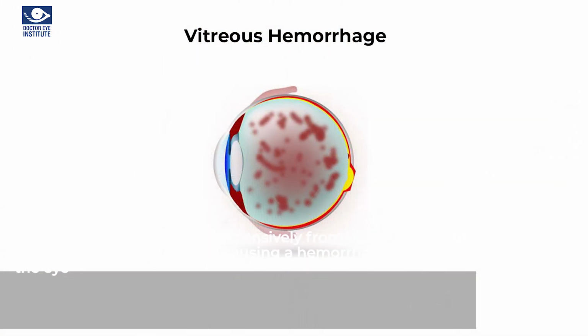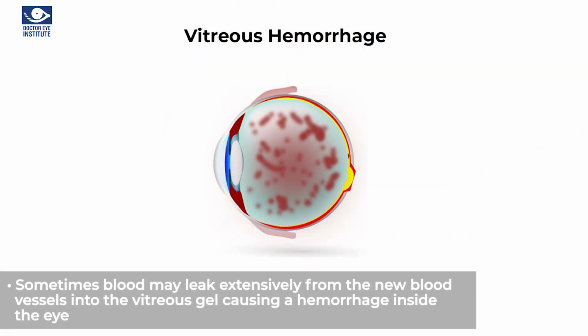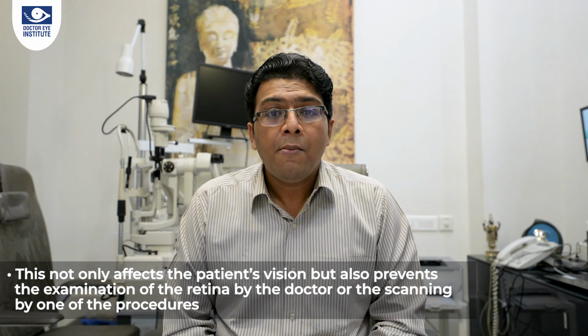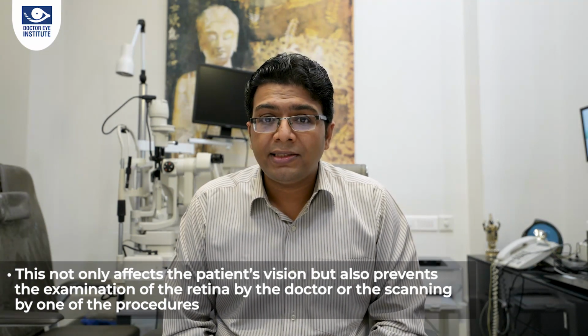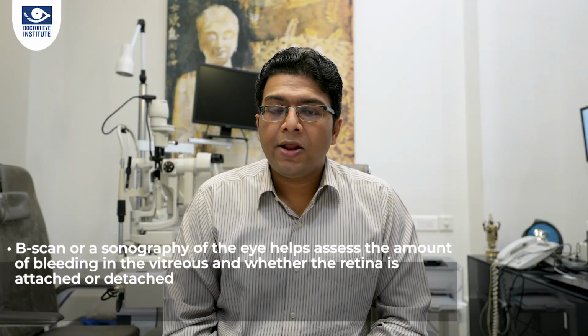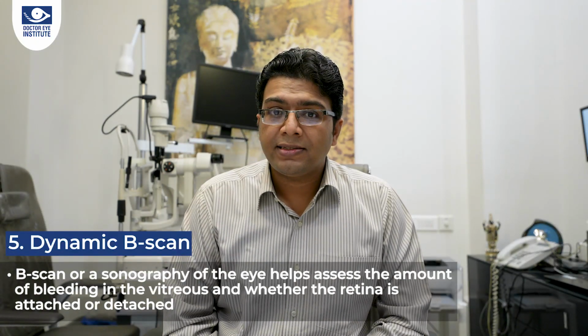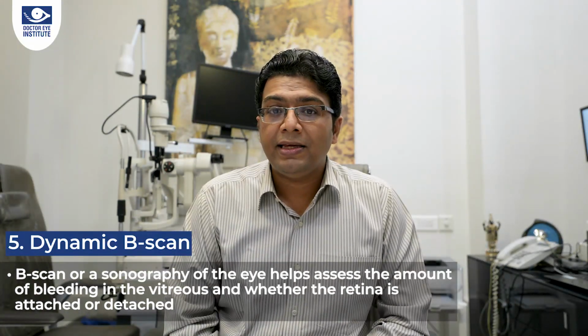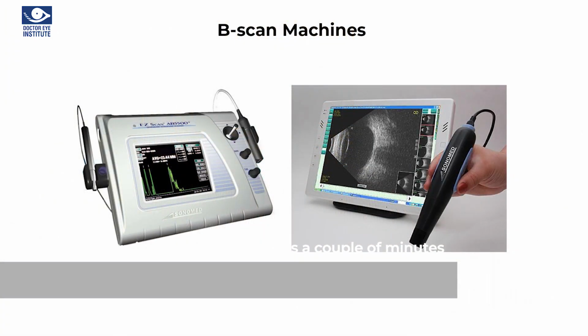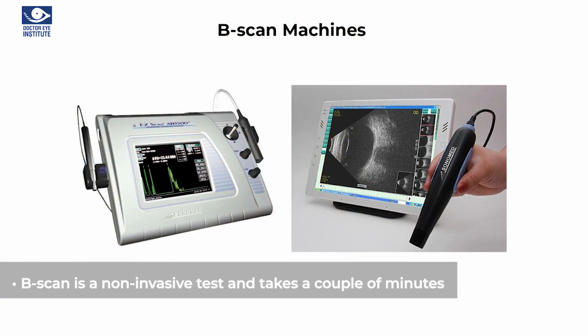Friends, in advanced diabetic retinopathy, blood may sometimes leak from the new blood vessels into the vitreous gel of the eye, causing a severe bleeding or hemorrhage inside the eye. This not only obscures the patient's vision but also prevents examination of the retina by the eye doctor or scanning of the retina by the OCT or the fluorescein angiography. In such cases, a B scan or a sonography of the eye helps to assess not only the extent of hemorrhage or bleeding inside the vitreous gel but also the status of the retina behind. The B scan is a non-invasive test and requires only a couple of minutes.